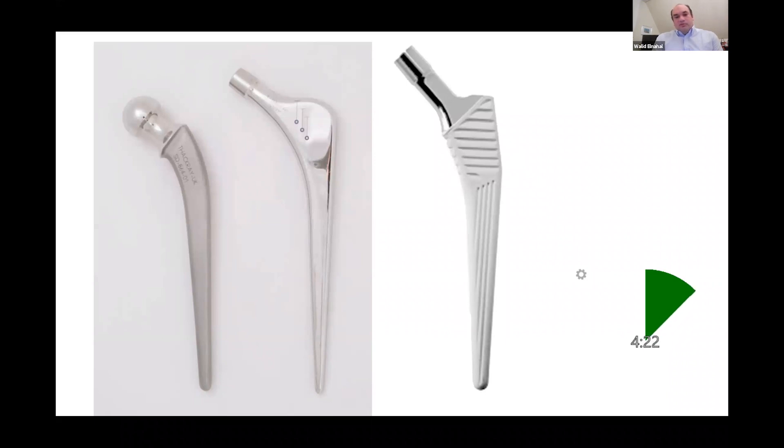It's a fully coated hydroxyapatite, fully coated stem. The two to the left, you've got the Exeter stem and the Charnley stem. Regarding the uncemented stem, the Corail stem, it has a trapezoidal upper metaphyseal component, and the one in the picture is a collarless design.